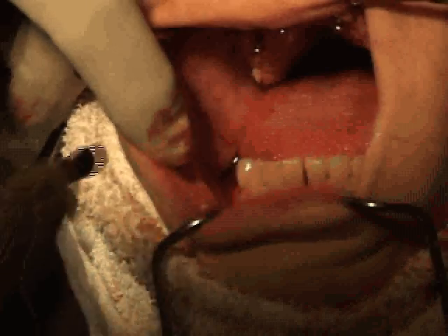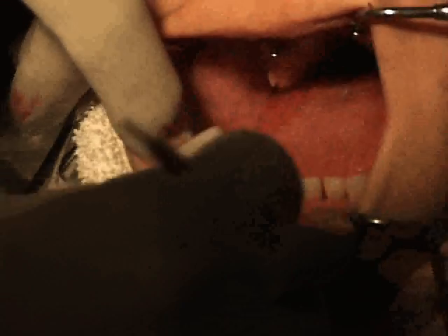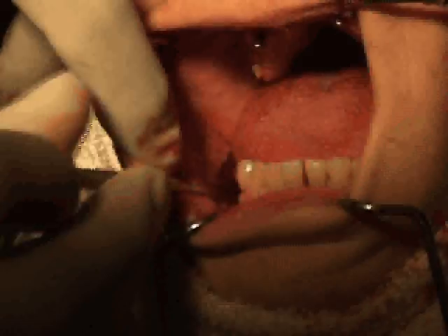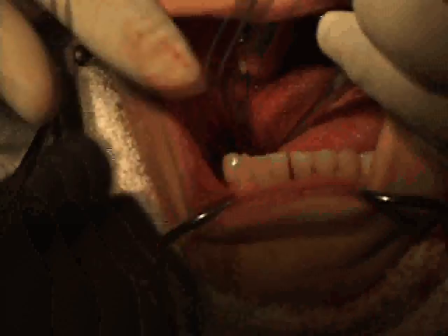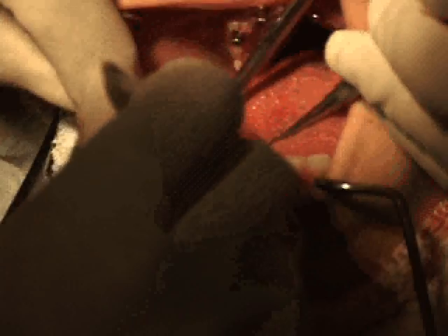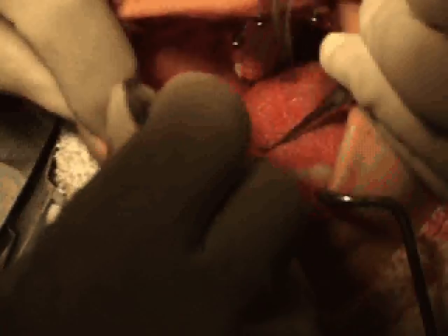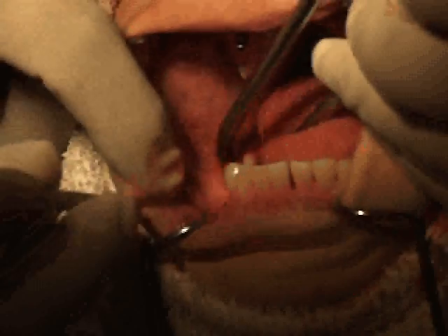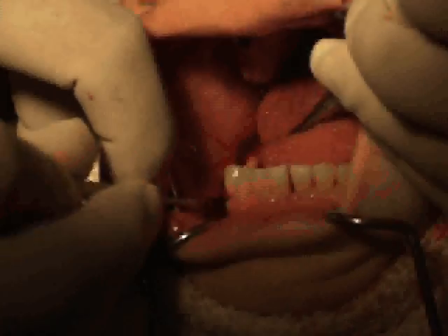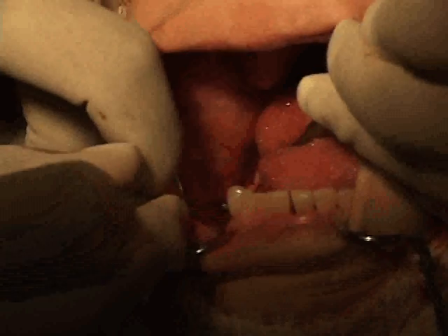The ridge is very carefully bisected with a number 15 scalpel, and care is taken to very carefully bisect down the middle of the little fibrous band of tissue from the retromolar pad to the anterior teeth. I'm reflecting the tissue with a number 6 waxing instrument. I found that this instrument is a very nice periosteal elevator because it's very small and very easy to manipulate.